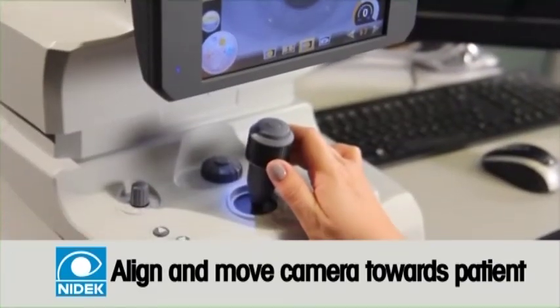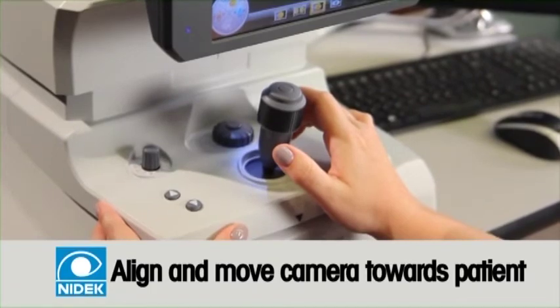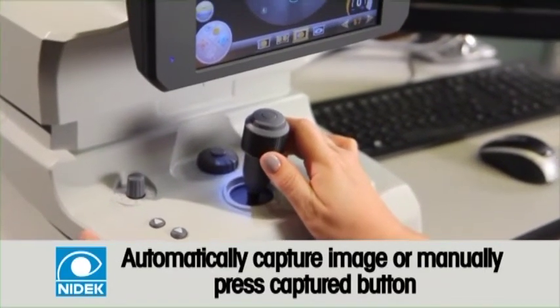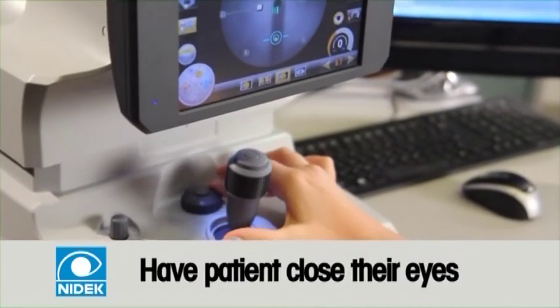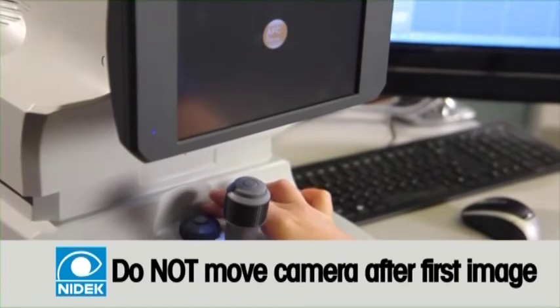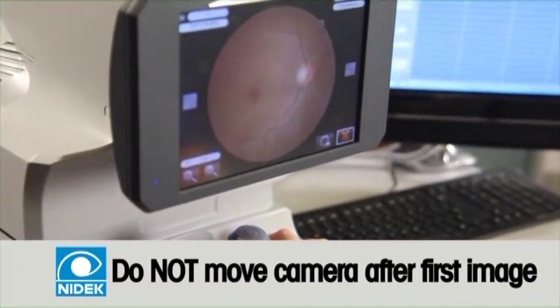Have the patient open wide while not moving or blinking. The camera's automatic functions will take over and the image will be captured. If needed, the operator can press the capture button on the joystick to override and capture the image. After capturing, have the patient close their eyes until the operator is ready.